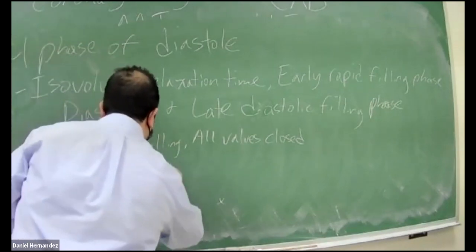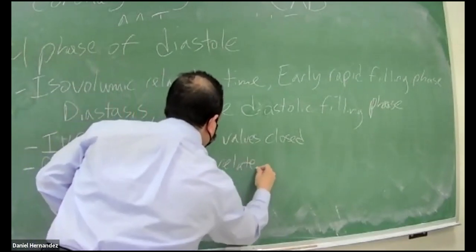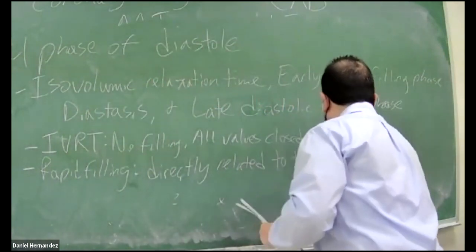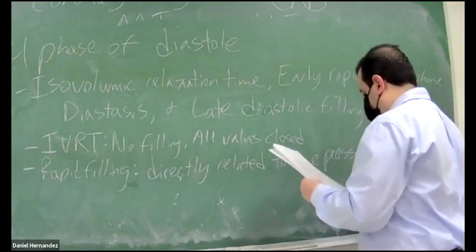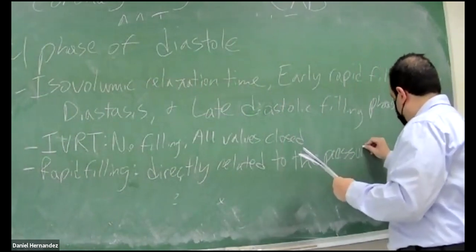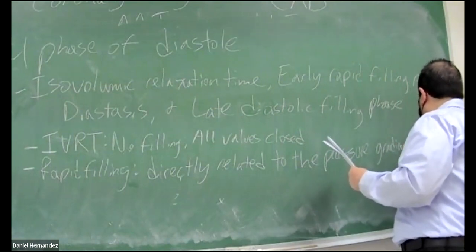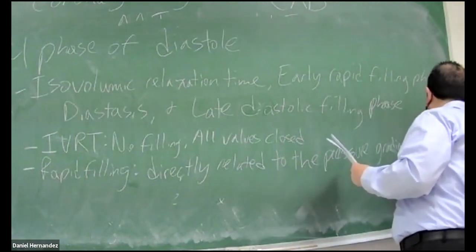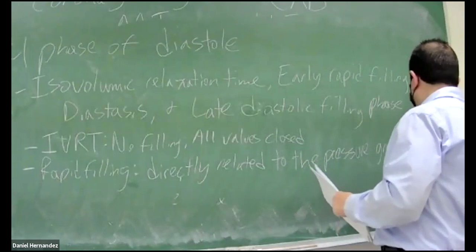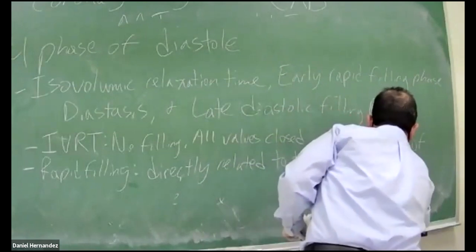And this is directly related to the pressure gradient between the LV and the LA, or LA to LV. Directly related to the pressure gradient of LA to LV.